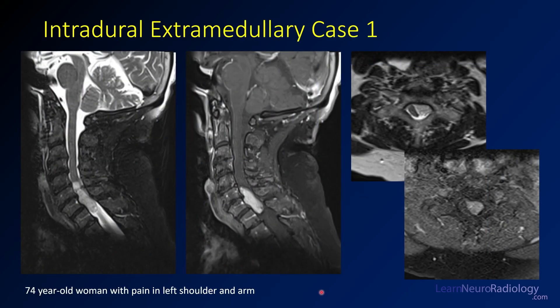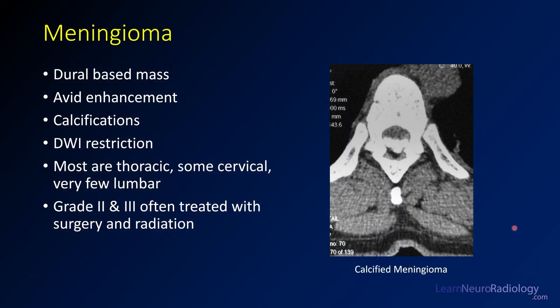Now we're going to look at some intradural extramedullary cases. Case number one: a 74-year-old woman with pain in the left shoulder and arm. On fat-saturated T2, you see a pretty well-demarcated mass within the spinal canal — the dura is outside it. On post-contrast fat-saturated images, you see the same thing: a well-demarcated mass with pretty homogeneous enhancement. On axial images, the spinal cord is deflected to the right, with significant mass effect. This is an example of a meningioma.